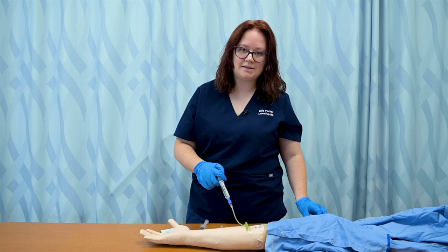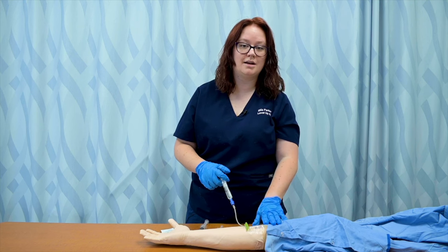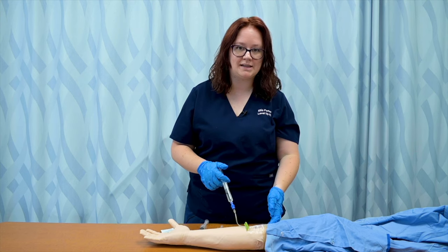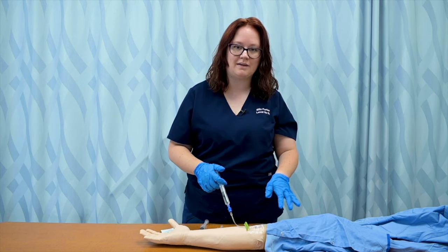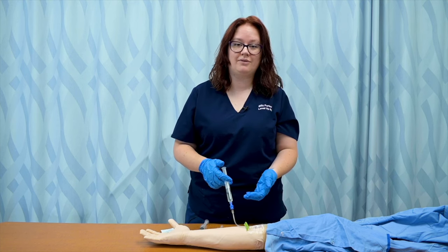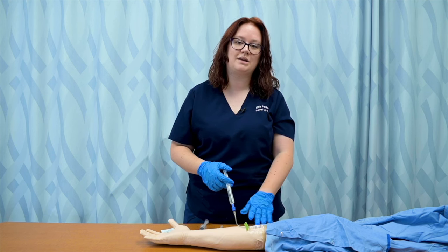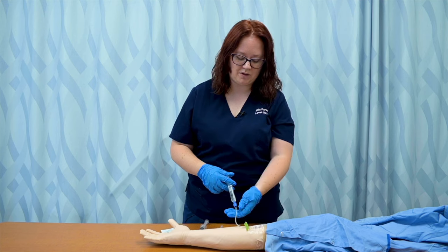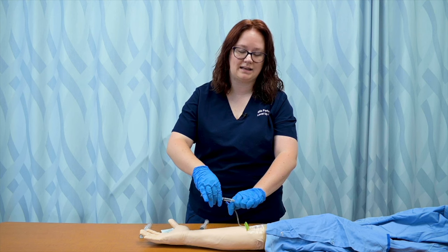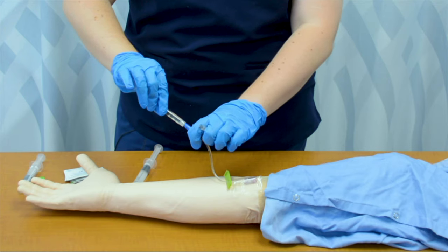The reason I do this on a saline lock is just to double check that this IV is still patent, because I don't have something flowing through it that I'm able to assess is actually running through a patent IV site. I need to double check that with normal saline, because normal saline could be safe if that IV were not in the vein any longer. So if normal saline were to get into the surrounding tissue, that might be okay. But what if my medication would be dangerous to get into that surrounding tissue because it is intended for intravenous purposes? So I've gone ahead and flushed.